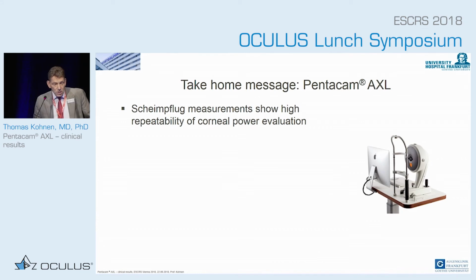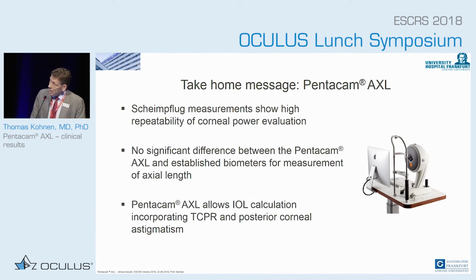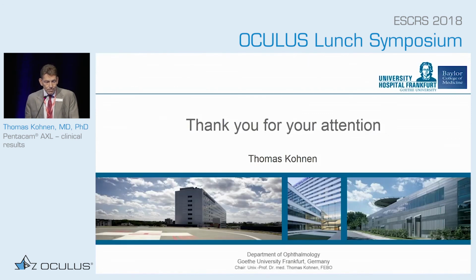The take-home message: Scheimpflug measurements show high repeatability of corneal power evaluation, no significant difference between the Pentacam AXL and the established biometers for measurement of axial length, and the Pentacam allows IOL calculation incorporating the posterior surface, which is the total corneal refractive power if you count both together, and the posterior astigmatism. And I think this is our next step because we will have one device which does both, which we usually have to combine. Thank you.